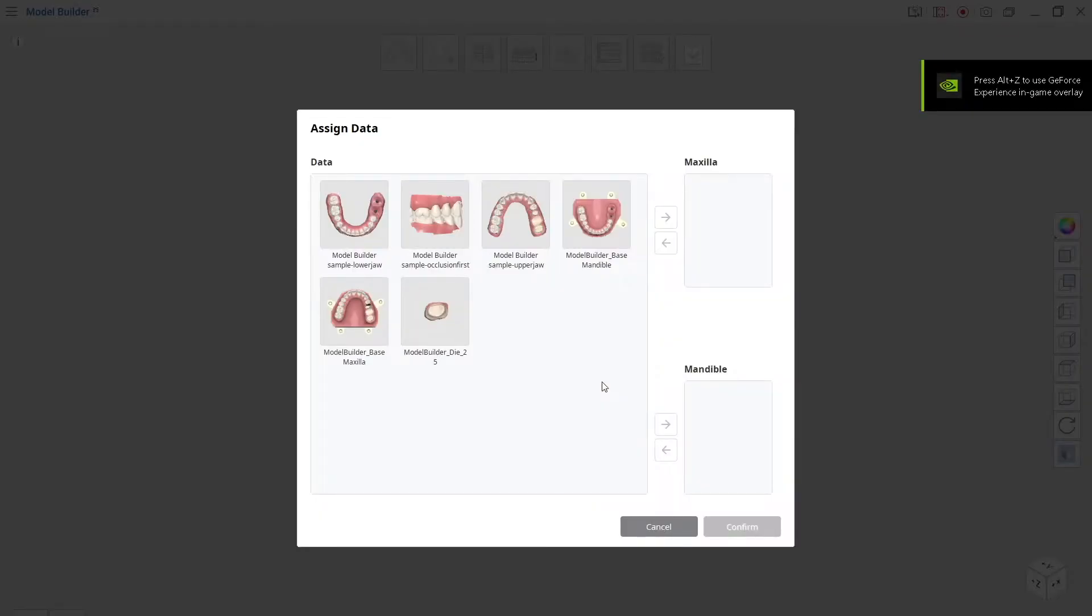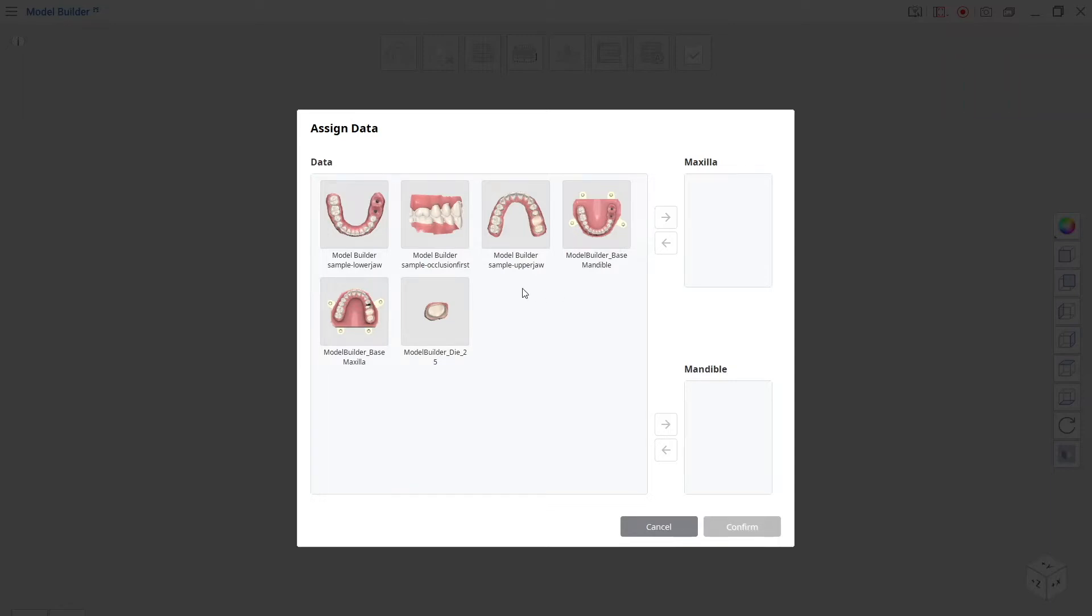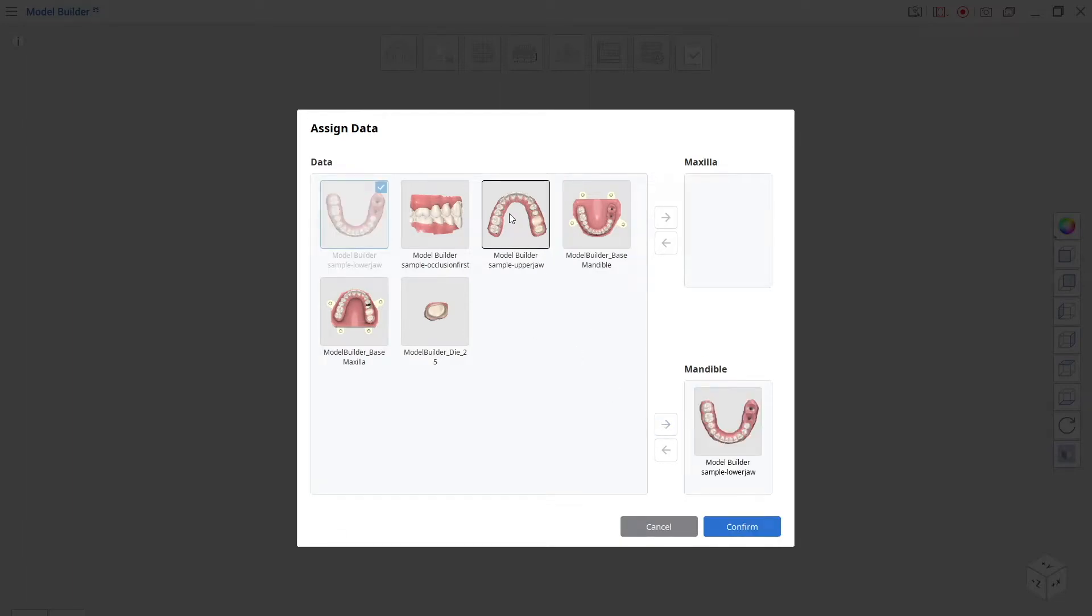When you first load it up we've got to select the maxilla and mandible. You can see all the files in the directory here, so we need to select the lower jaw, pop it into the mandible by clicking the arrow. We're going to select the upper jaw and select it across to pop it into the maxilla. Once we've done that we'll click confirm.